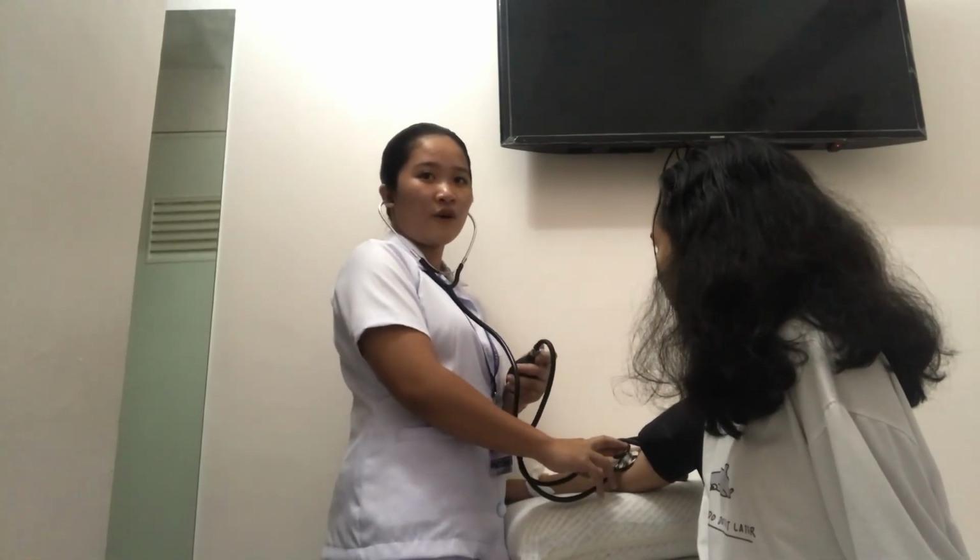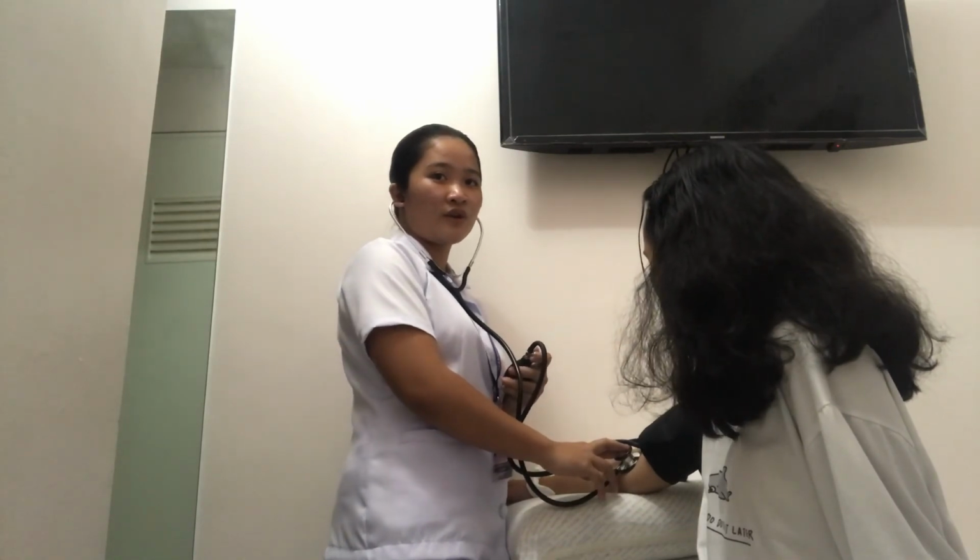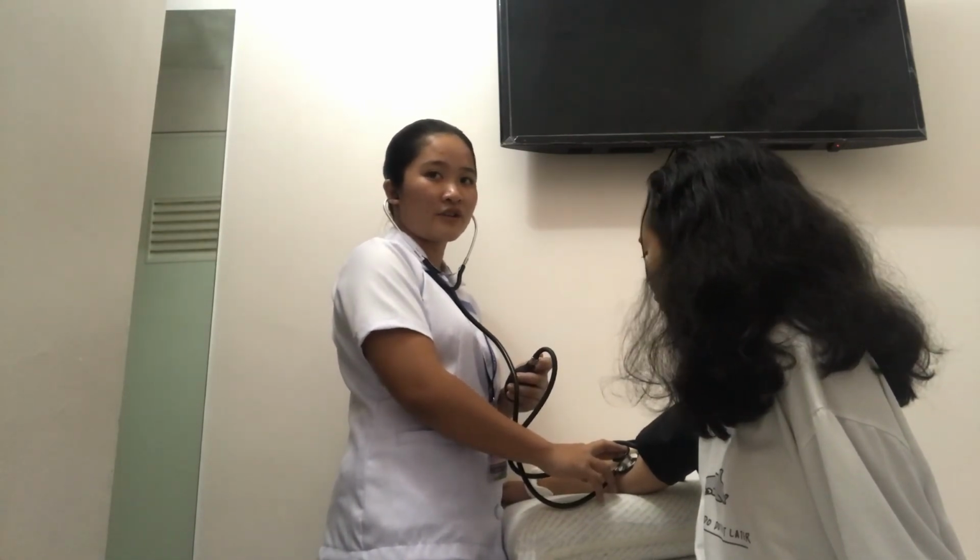So once I have found the brachial artery, I'm going to inflate the cuff until I no longer feel the pulse of her brachial artery.